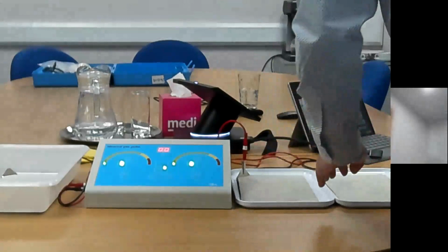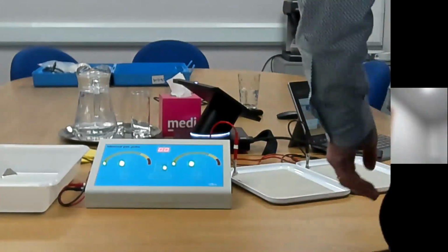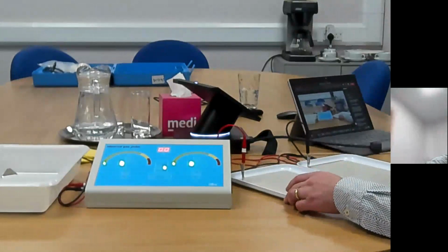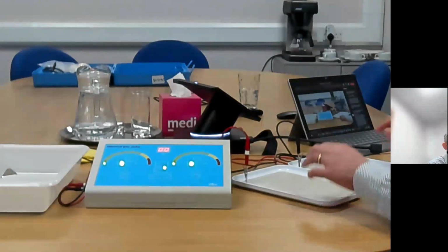So you would then ask the patient to be sitting comfortably. Make sure they take any jewellery off that's on the line of the current. They remove rings off fingers. Anything that's above the head and neck is perfectly safe to leave. Anything that's on the torso, so belly button piercings, other piercings they might have, make sure they get removed.